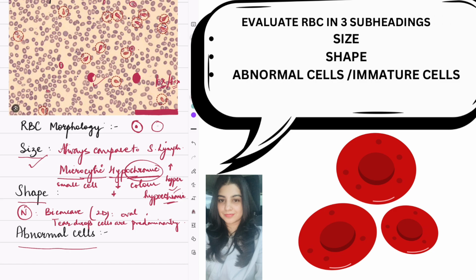Size will be okay, but there will be a central dot of hemoglobin, then pallor, and then hemoglobin. I'll explain it in the next slide maybe. So in this peripheral smear, only teardrops are present, and size is microcytic hypochromic.